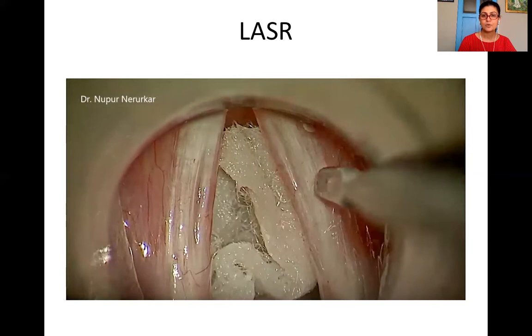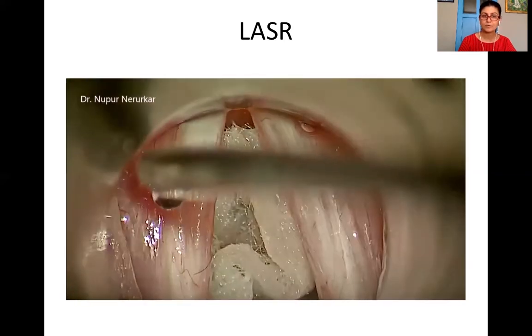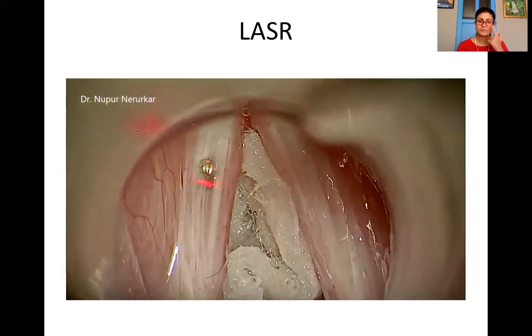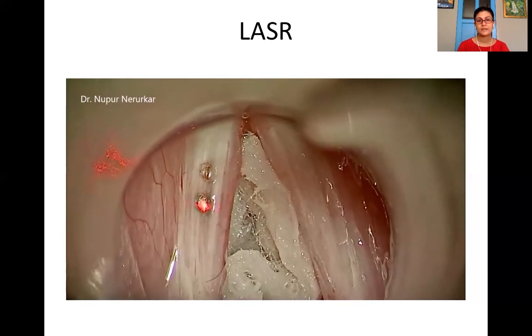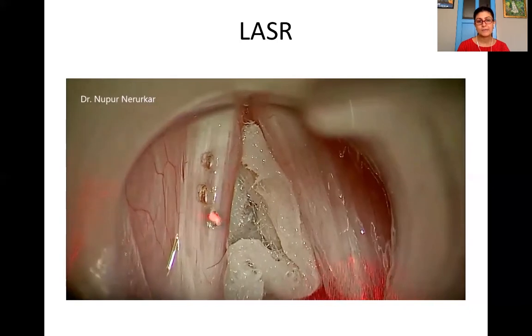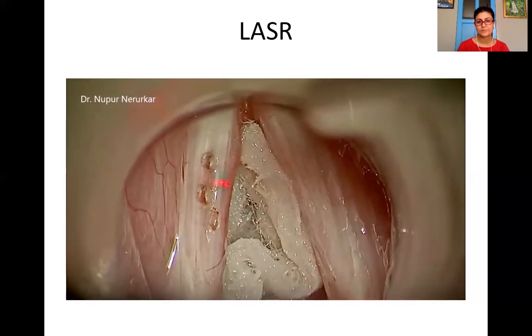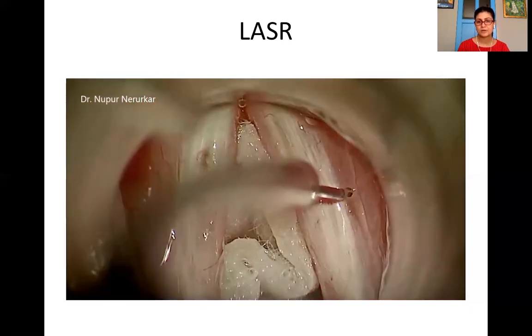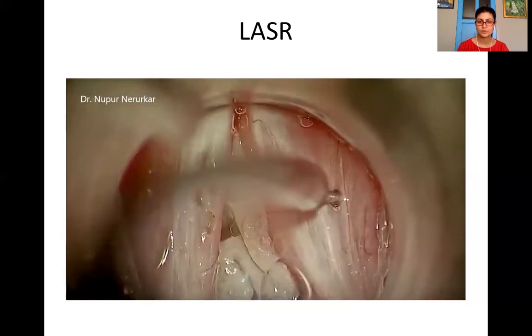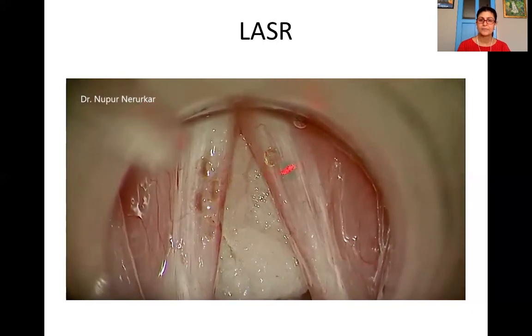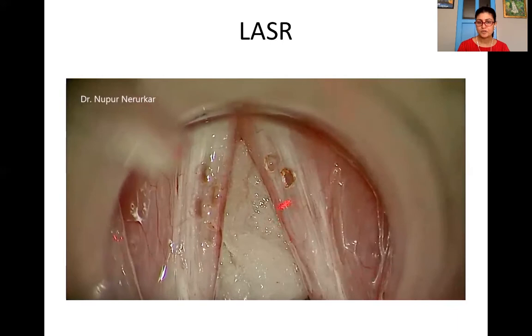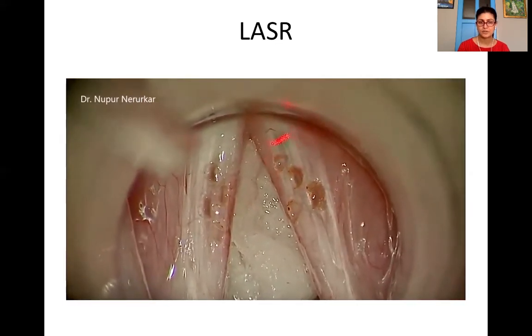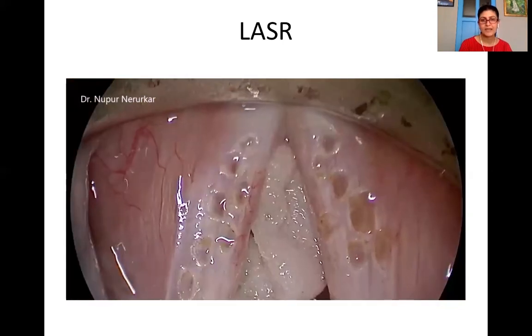Here we demonstrate palpation. There are two type A sulci on the right vocal fold and two type A sulci on the left vocal fold. The subepithelial infiltration technique has been performed on the left vocal fold, making the sulci more apparent. The AccuBlade is used at 0.5 millimeter length, cutting the lips of the sulci at 90 degrees. We ensure the distance between cuts is at least 0.3 to 0.5 millimeters and do not go into the anterior commissure, respecting it at all times. The similar process is then performed on the right side. The goal of the LASR technique for superficial sulci is that secondary epithelialization takes place in a fashion that does not again cause a furrow or depression. We allow time for healing and then provide voice therapy.